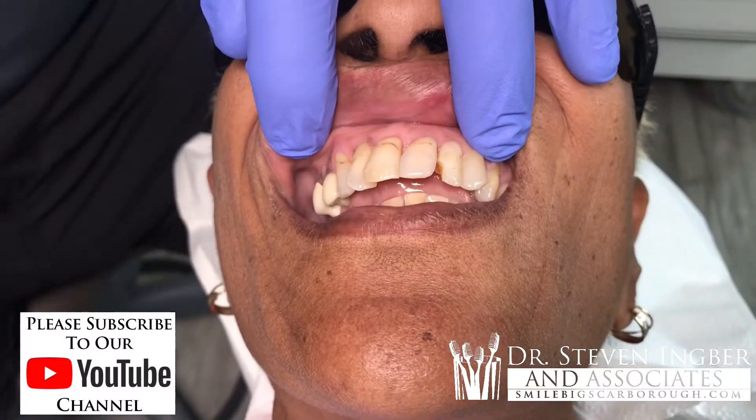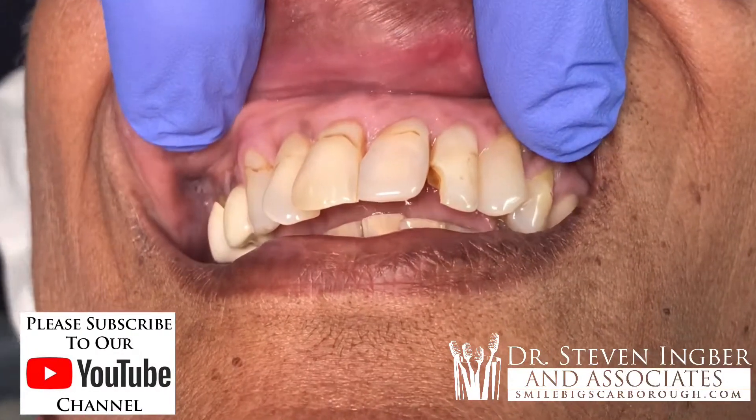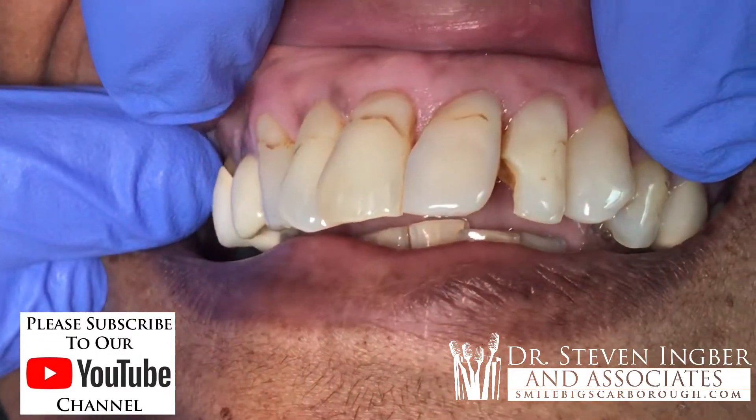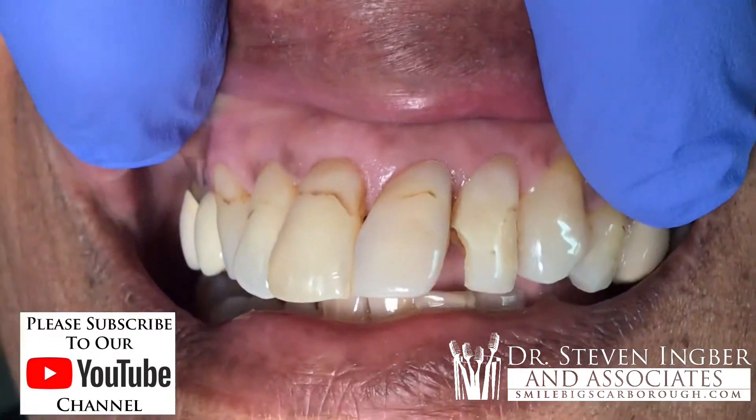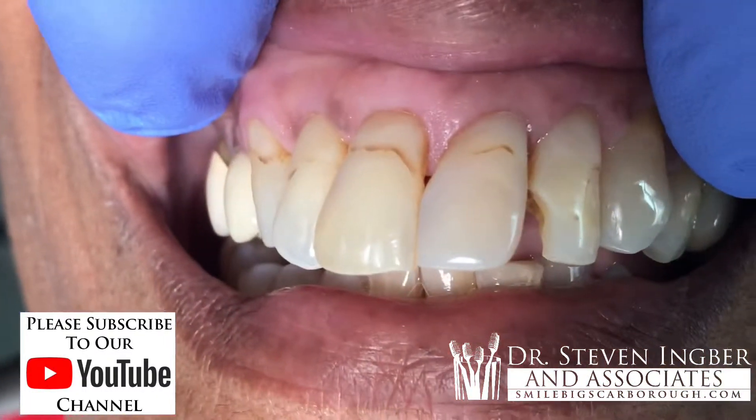We're going to do some dentistry on Jennifer here, and she's a very, very sensitive patient, and I'd like to do it without freezing. She doesn't like that idea, but you can see a whole bunch of fillings here that have staining around the margin.